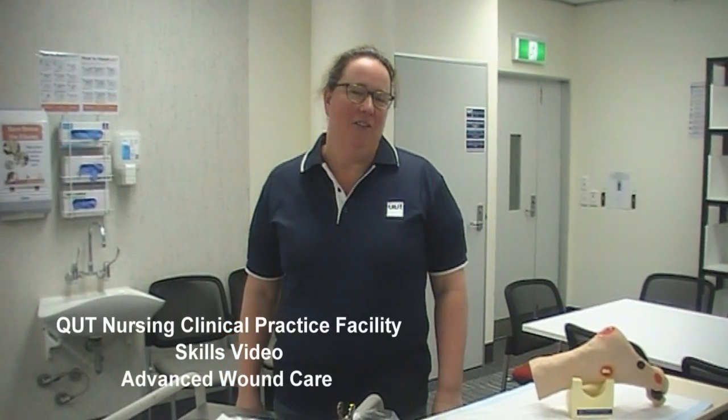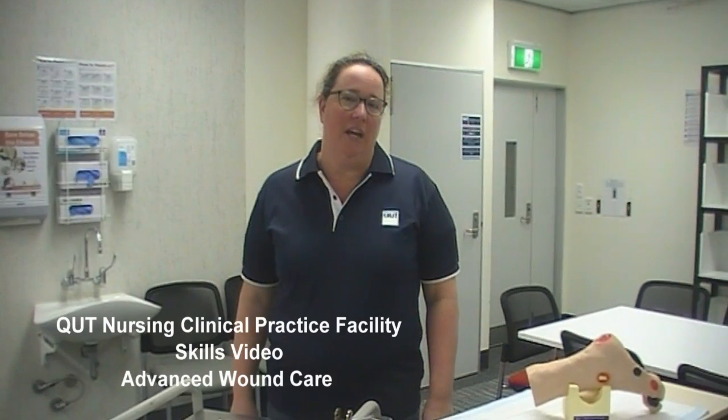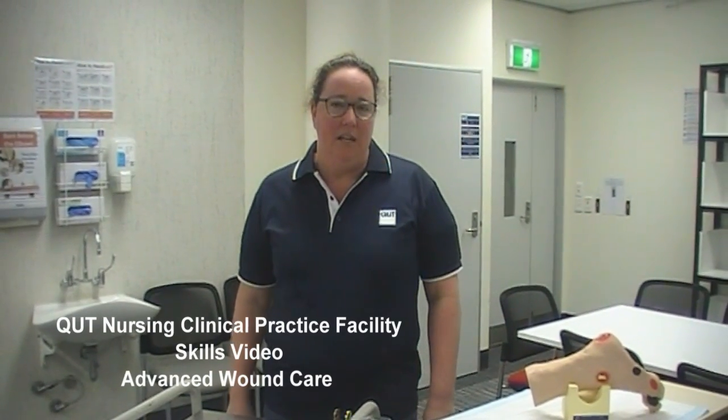My name's Jodie and I'm here at QUT Clinical Practice Facility and I'm going to show you today a complex wound dressing. This is an area that you need to be confident and competent in as a student and a registered nurse once you're out on prac.